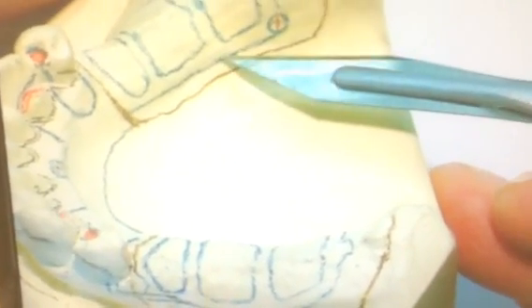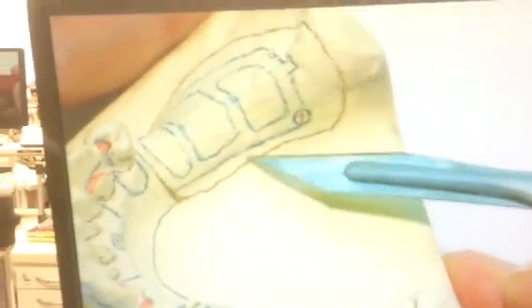It's a little light. And this meshwork drops down a little far on the lingual because it's left the gap between the metal and the acrylic very narrow here. And I would rather see this open lattice up a little bit higher on the ridge with these windows moved up just a little bit so that we have a little bit more thickness to our framework.